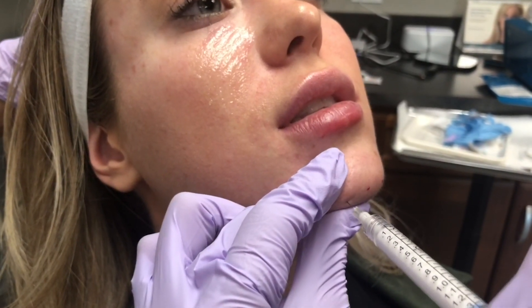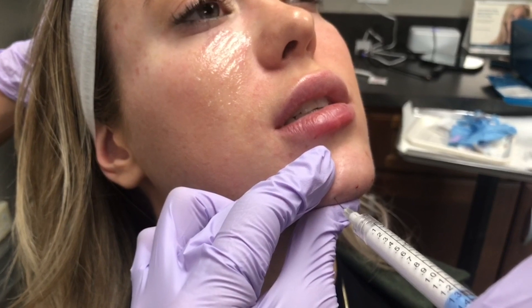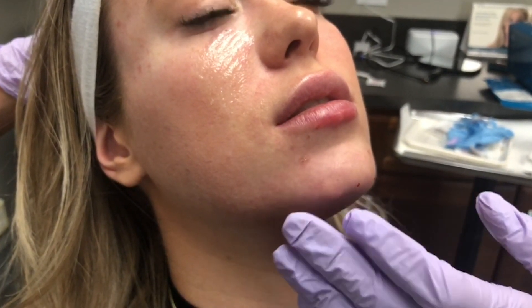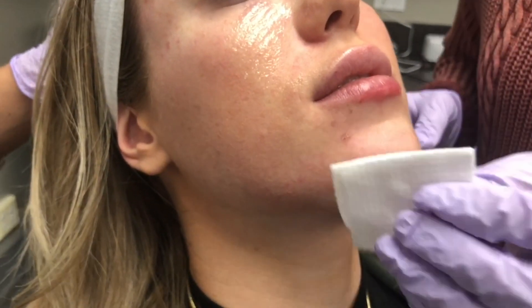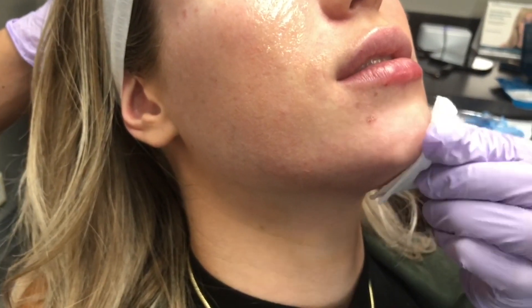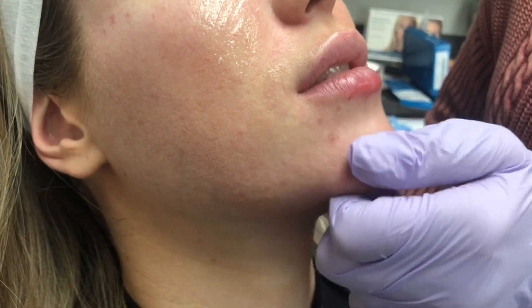You can see here the injector is going straight in down to the bone, pulling back slightly. She's aspirating. This is the safest injection technique we can offer — always aspirating before placing your product, especially when using Radiesse. Radiesse is a filler that cannot be dissolved, compared to hyaluronic acid fillers which can be reversed with hyaluronidase. We don't have that safety net with Radiesse, so we always want to make sure we are taking all proper precautions to prevent any complications from arising.